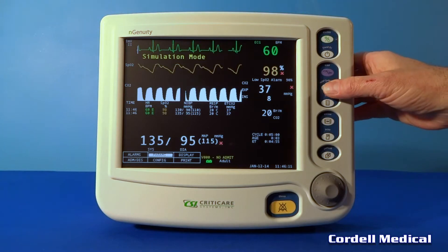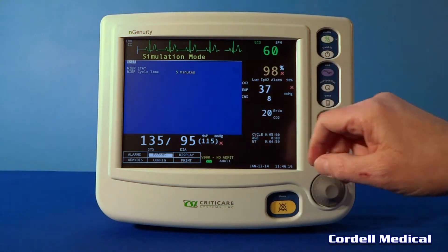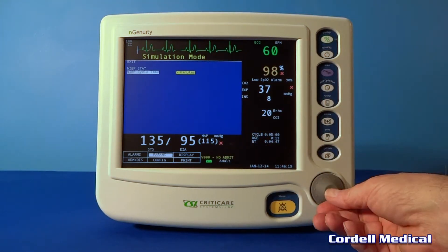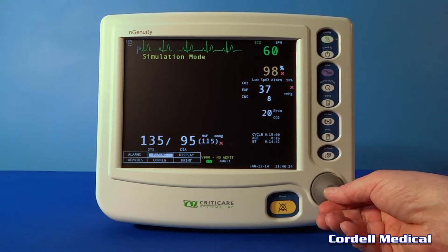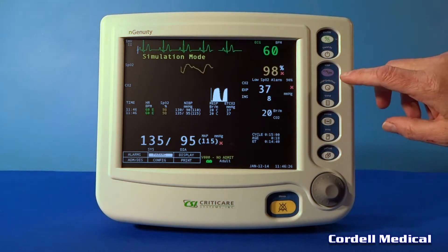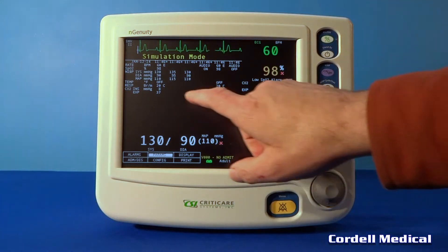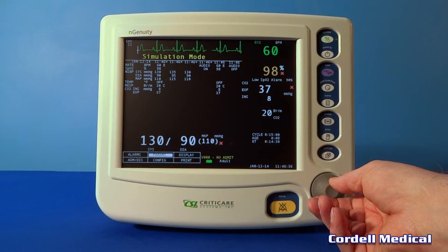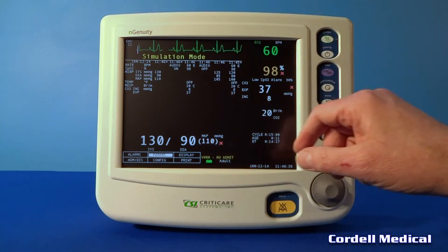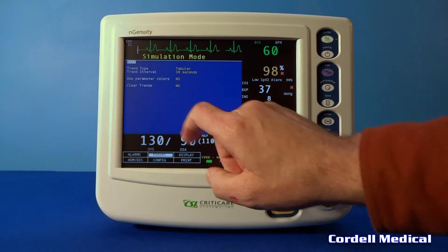NIBP cycle stat sets the NIBP cycle time. Right now it's set for five minutes. You can set that time for wherever you desire. The trend button views past vital signs. You may also clear the trend memory by pressing and holding the trend key, then scroll down to clear trends.